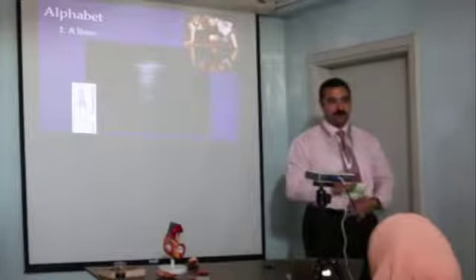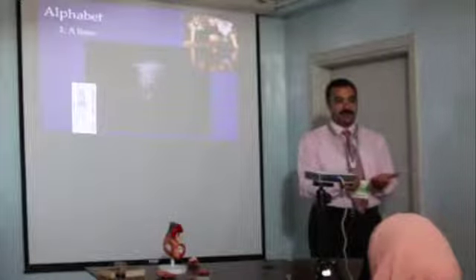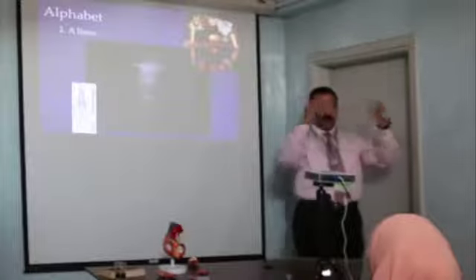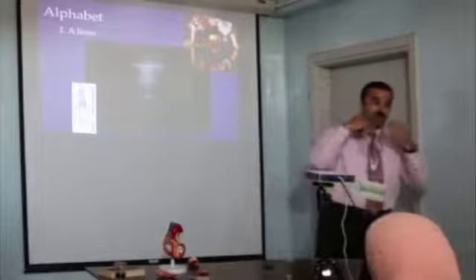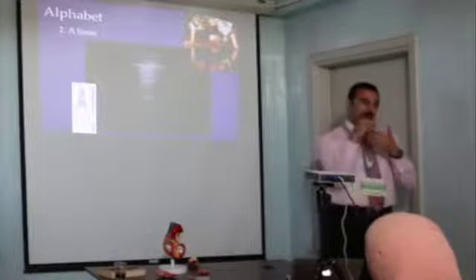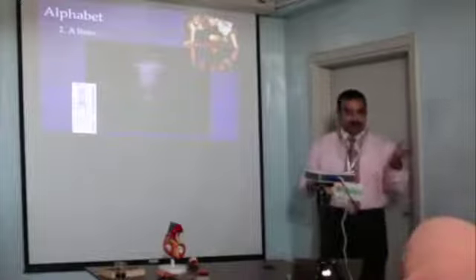Why does this mirror image appear only in the lung? Because the lung is the only tissue that contains air. Echo spreads in air, but if you try to do echo in water, it will be more difficult. Isn't it? Try to send some sound waves, it will become fainter, and you cannot observe it in water compared to the echo spreading in air. This is what I believe. Anyway.